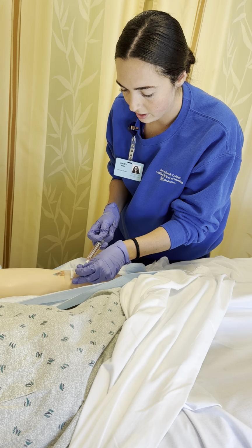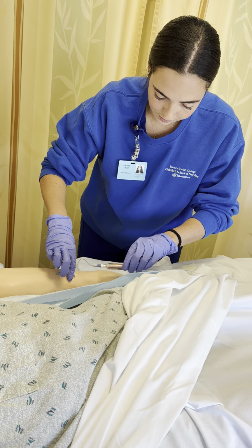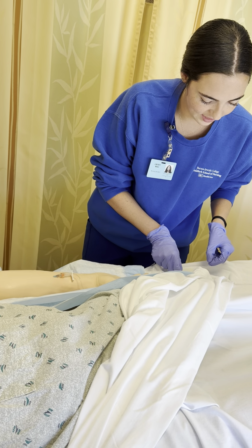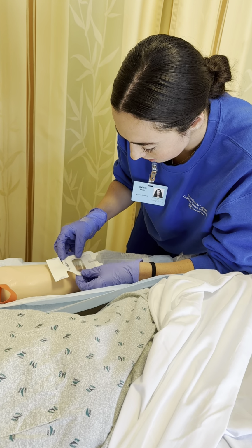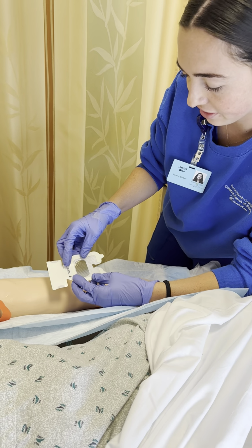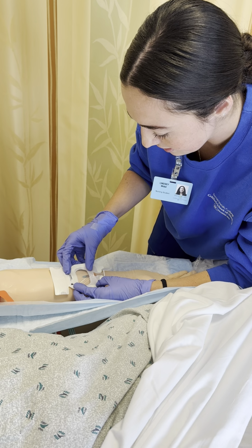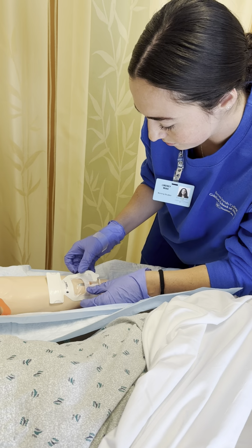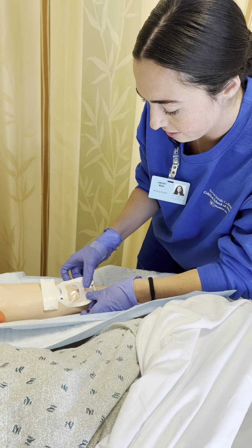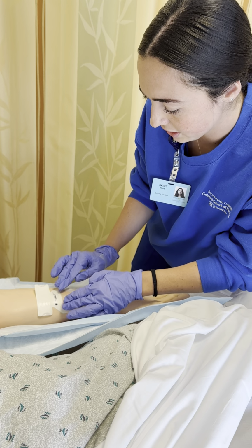Okay. Looks good. I'm gonna go ahead and take my, and I want to make sure that the catheter is within this window so that way you can see it. Place it on there. Are you still doing okay, Ivy? All right. Make sure everything looks good.